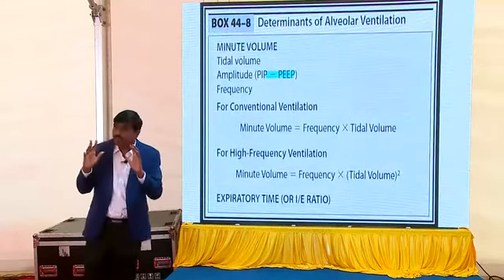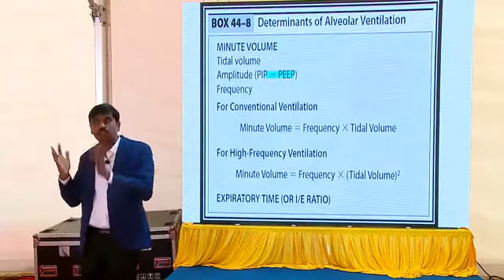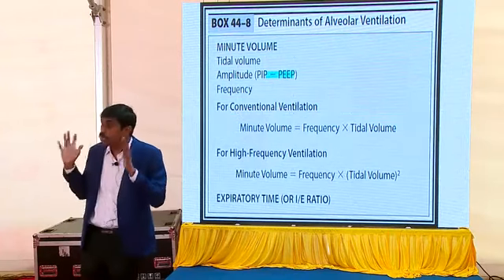So, one of the biggest determining factors for your tidal volume, that is how much air I can drive inside, would depend on the compliance.